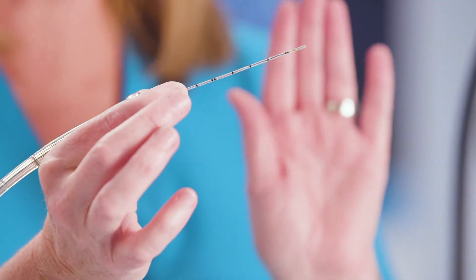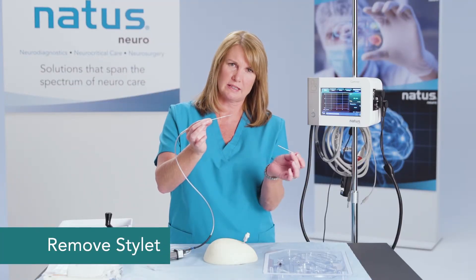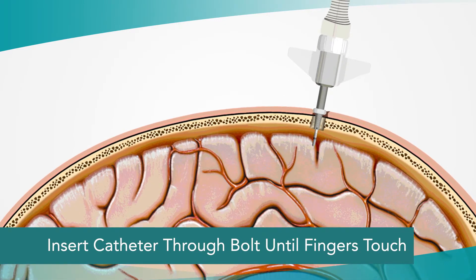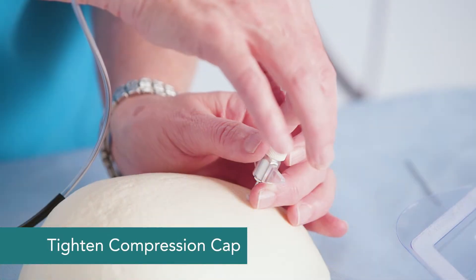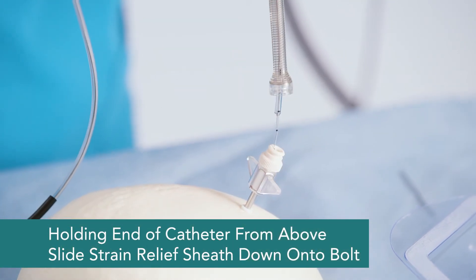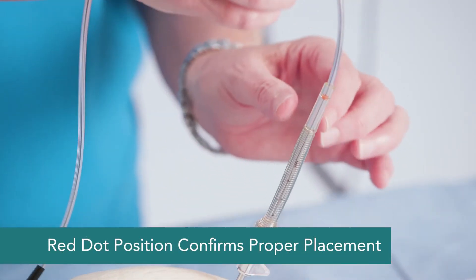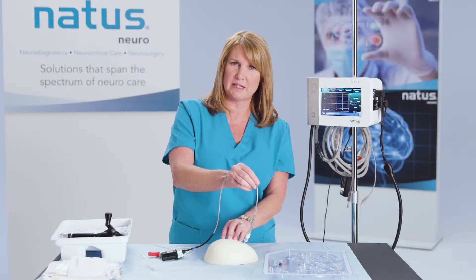I'll use the other hand to loosen the compression cap and remove the stylet. Then I'm going to slide this catheter down through the bolt housing until my fingers touch, and pull back slightly, just two or three millimeters. Tighten the compression cap above the strain relief sheath, slide this down and snap it into place. You should see that red dot right around the etched area of the strain relief sheath, which indicates the catheter is in proper placement.